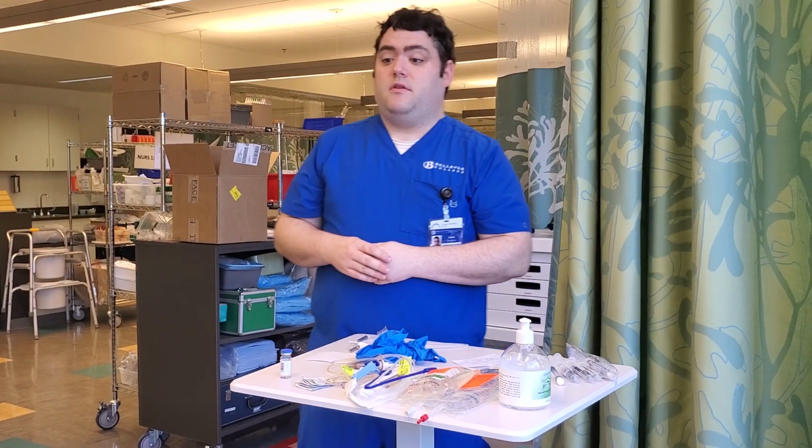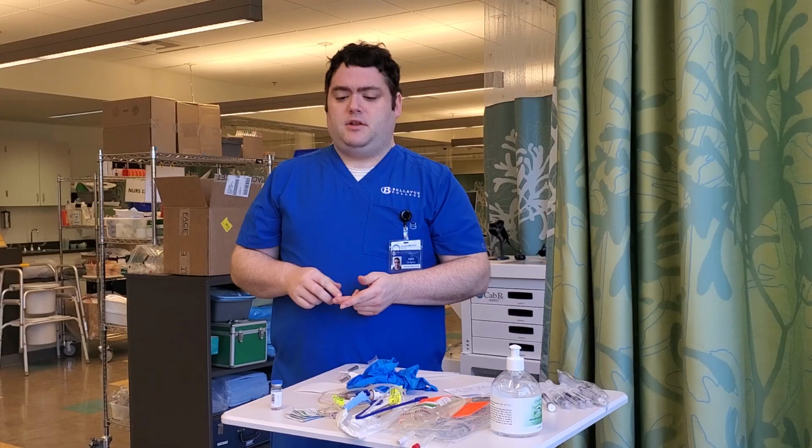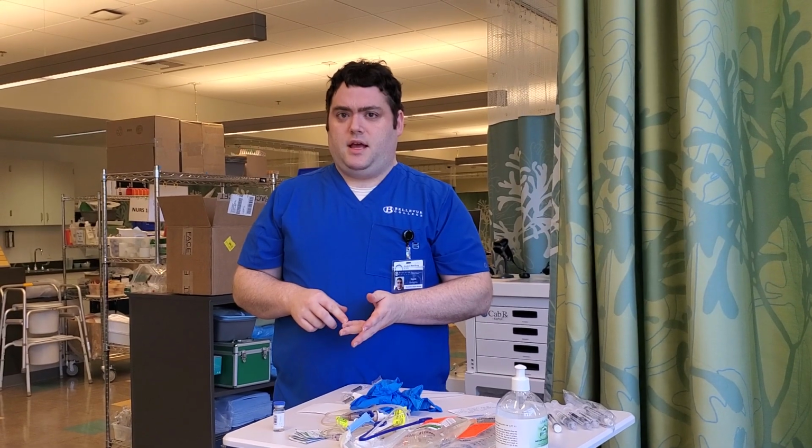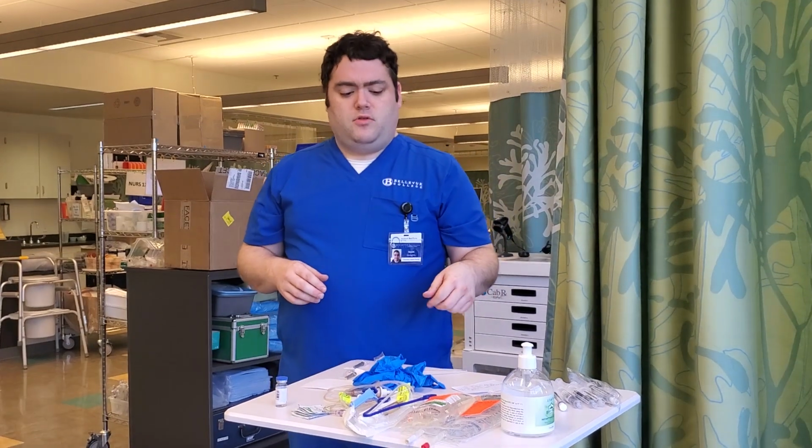As I said, we're looking at the expiration dates for each one, and we're doing the 5 rights for all of them. That would be right patient, right medication, right dose, right route, and right time. And so now over to the IV fluids.